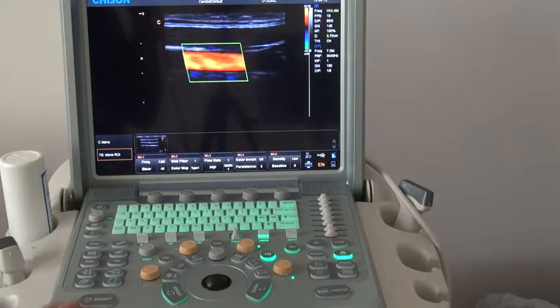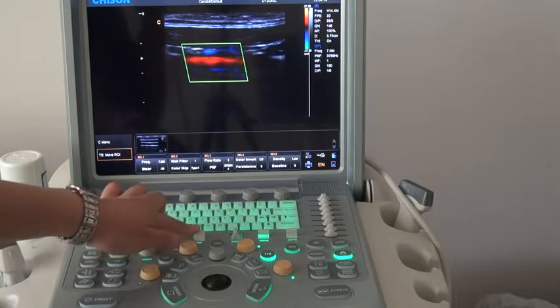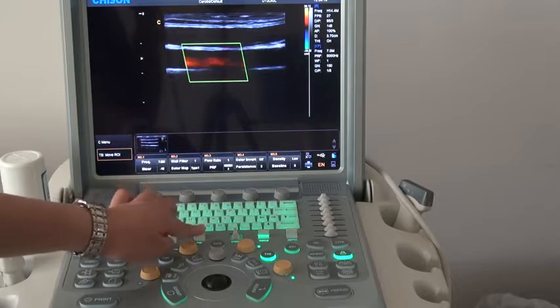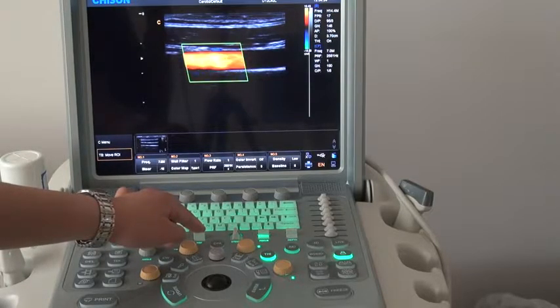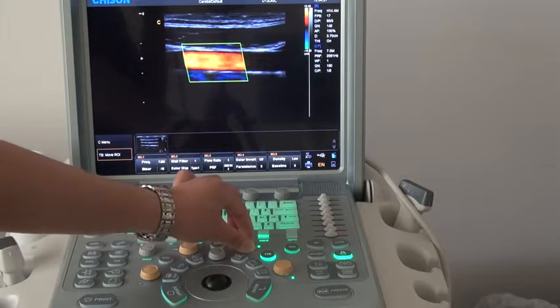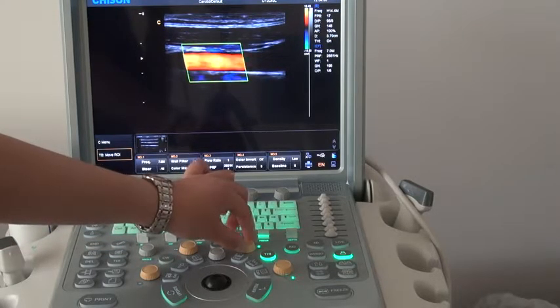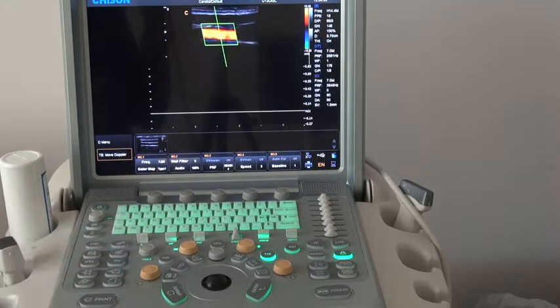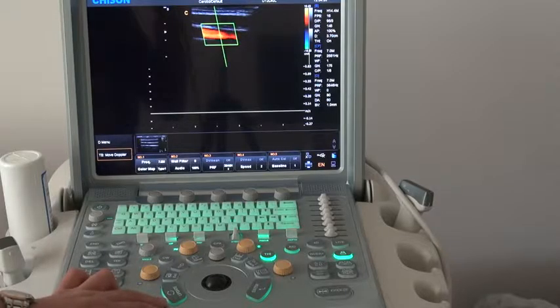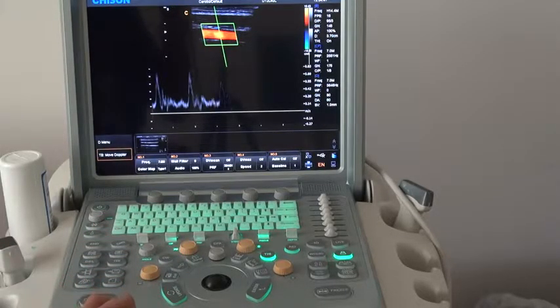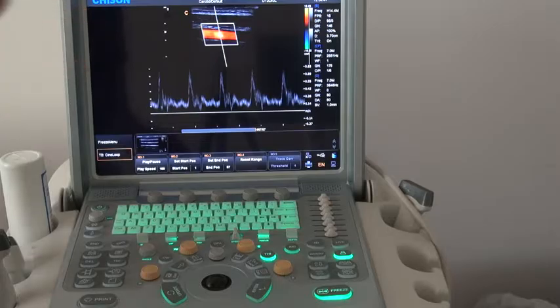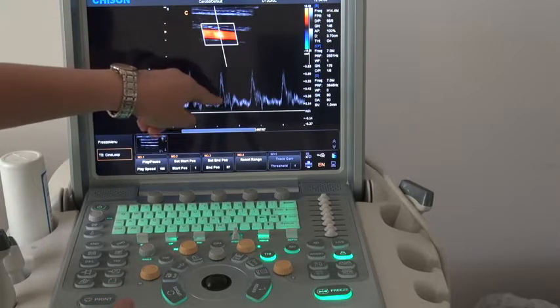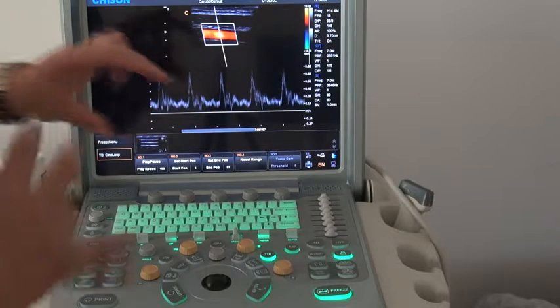In C mode, we can adjust the PRF value using this key. After that, we go to PW mode. You can find that for this spectrum it's very sharp and the background has no noise. The spectrum window displays very well, with no noise — it's very clear.